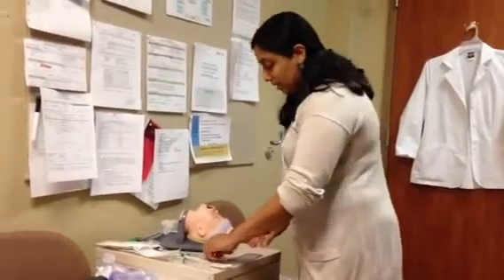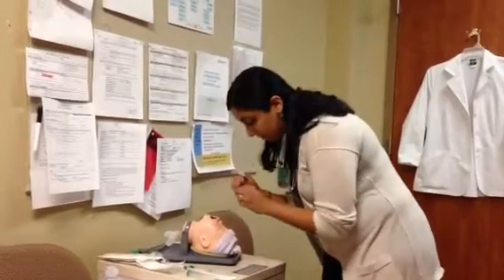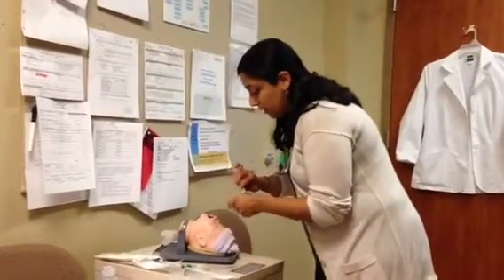Okay. So the first thing we're going to do to administer surfactant is you always have to have the infant intubated in order to do so. So we'll go ahead and intubate this infant.